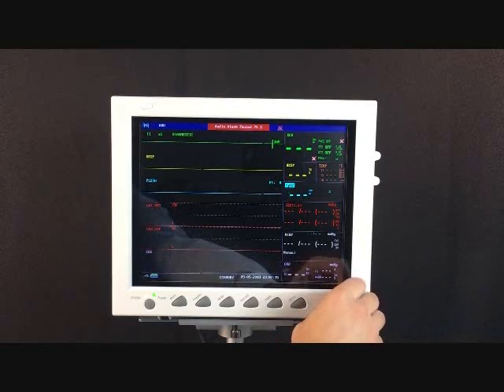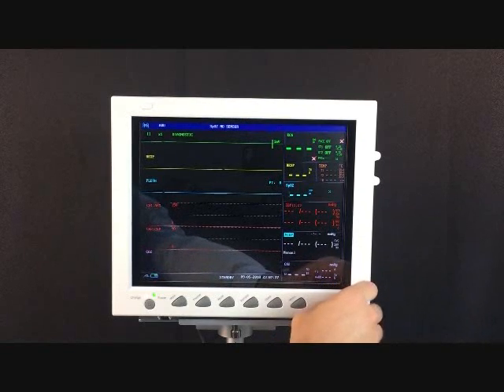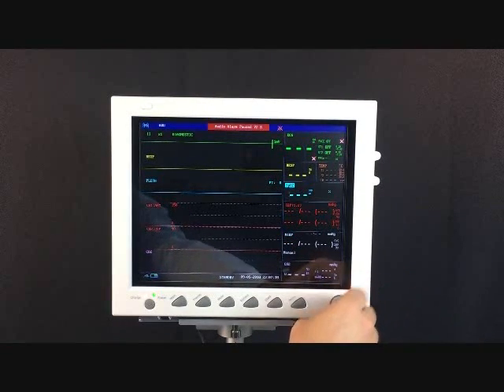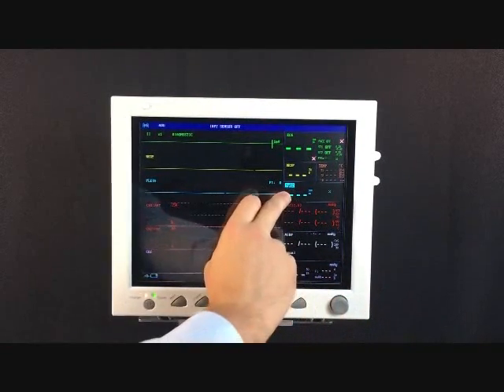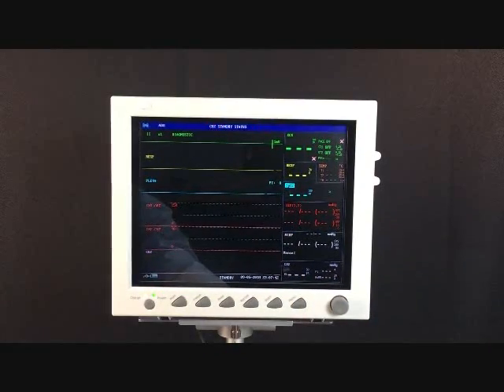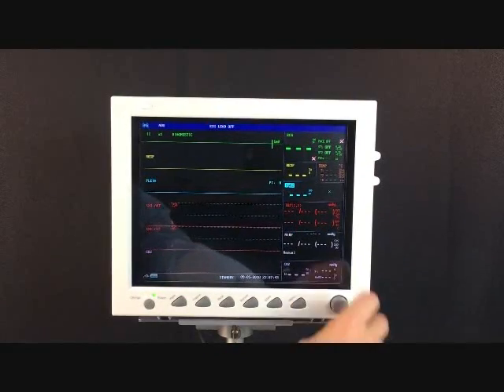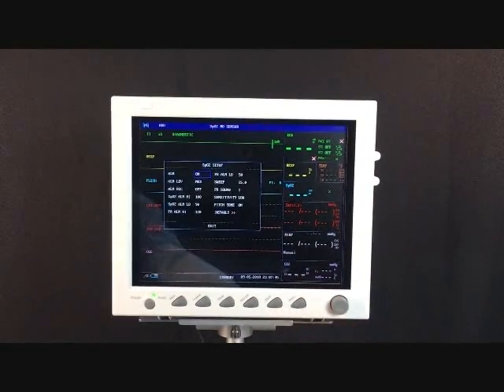If you want to control any of the settings for those specific parameters, like SPO2, look at where the blue square is hovering over the menu name and then click into it.